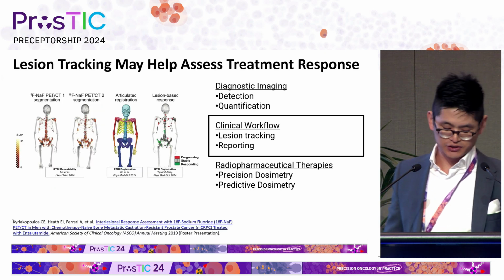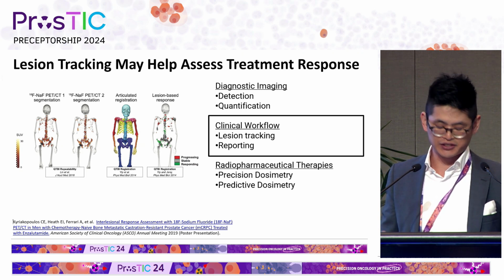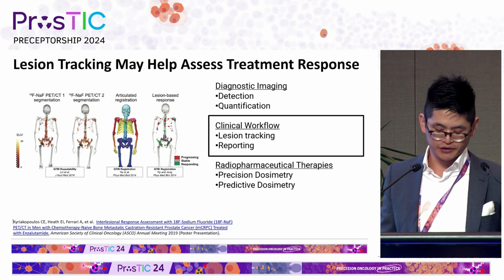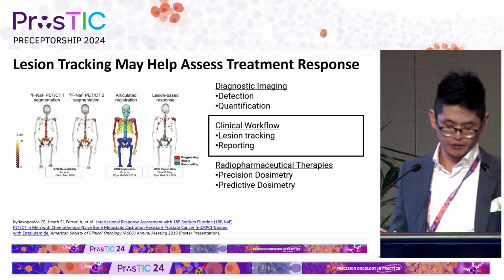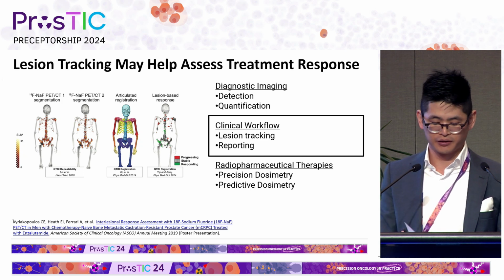As a radiologist, I already conduct lesion tracking for clinical trials via RECIST. It's time-consuming, and for example, in modified RECIST, we provide only up to 5 measurable lesions. If you really wanted to track every lesion, it has to be automated.